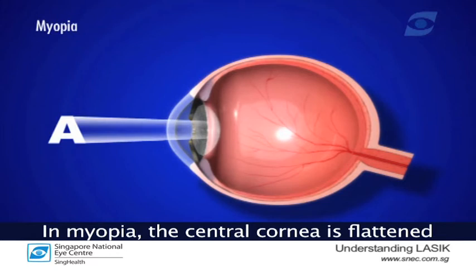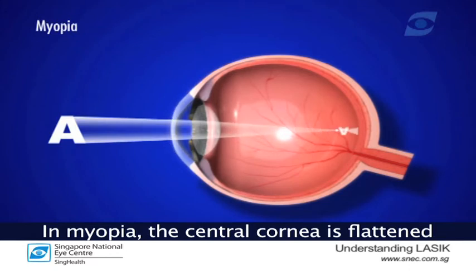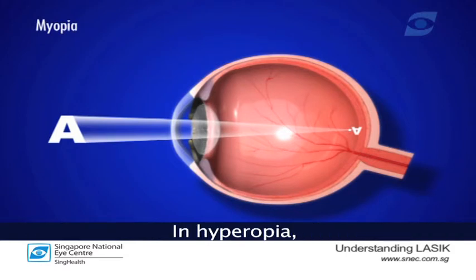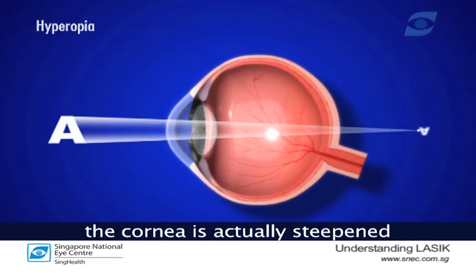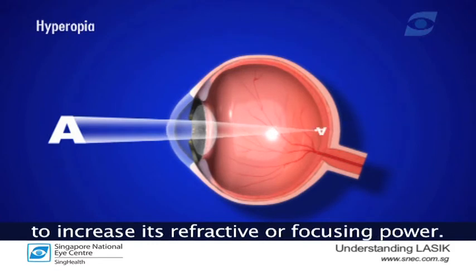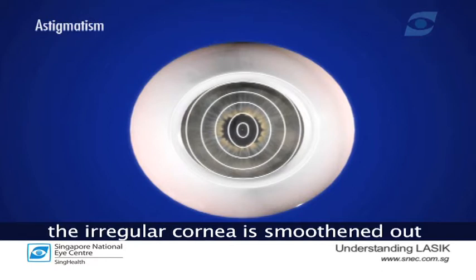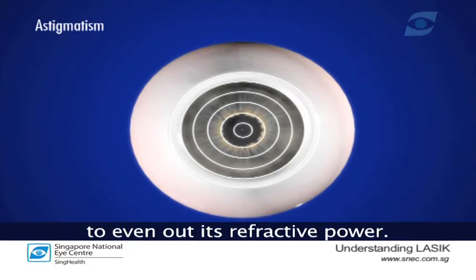In myopia, the central cornea is flattened to decrease its focusing or refractive power. In hyperopia, the cornea is steepened to increase its refractive or focusing power. In astigmatism, the irregular cornea is smoothened out to even out its refractive power.